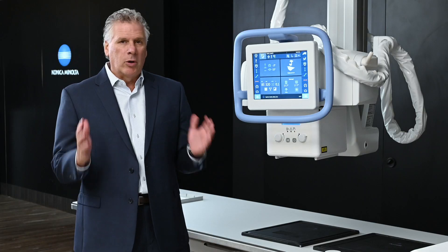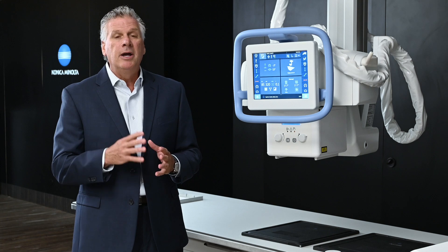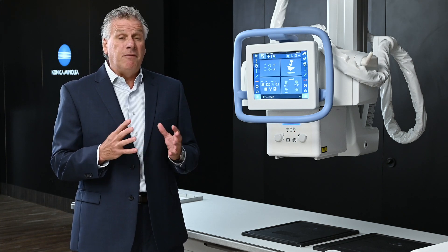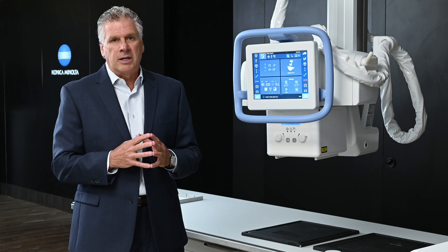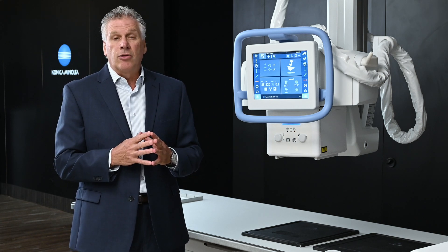Hello, welcome to Konica Minolta Healthcare. Today we are introducing the brand new overhead tube crane, the Flex. I am Bruce Ashby, Senior Vice President for Konica Minolta. We've been working on this project for four years and we're very excited to release this product. We are bringing it to the RSNA for its debut. Today we're going to explain and go through the features and functions that make this product so much different than the rest of the industry.